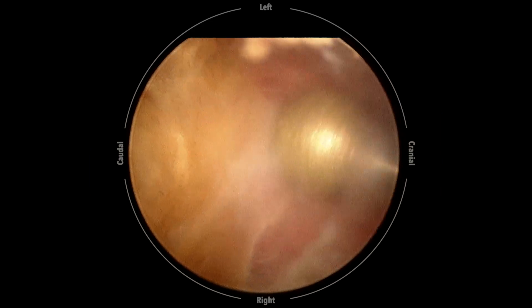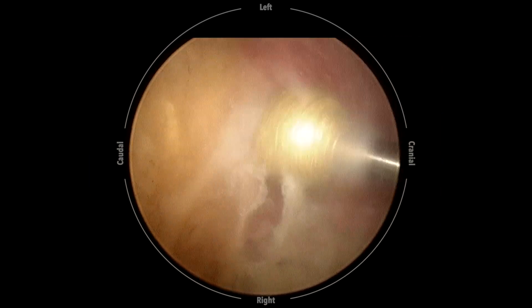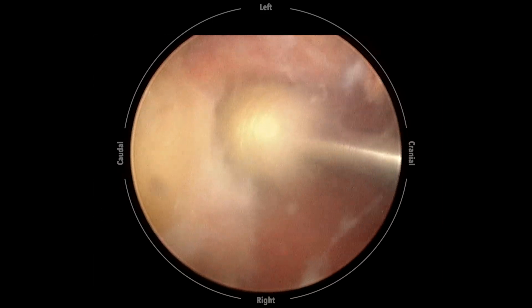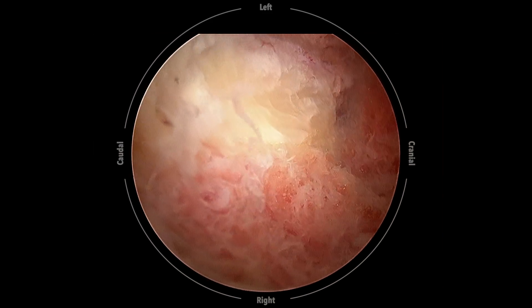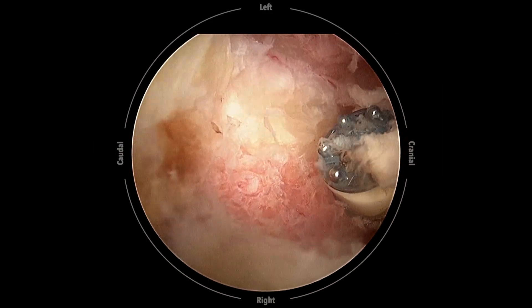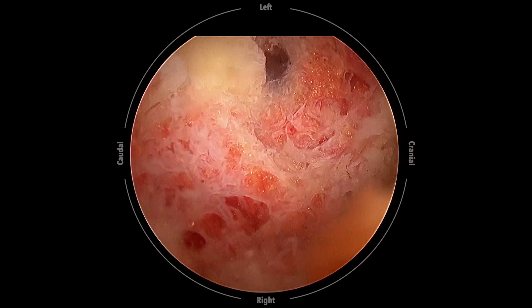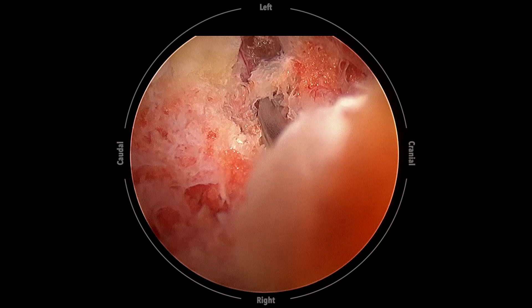The starting point of laminotomy is the conjoined part of the spinous process and the lamina, also known as the spinolaminar junction. After the cranial margin of the ligamentum flavum is exposed, we use straight and curved osteotomes to chop off the inferior articular process into small pieces.